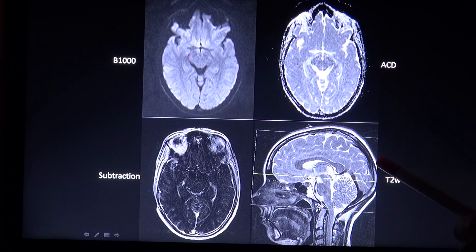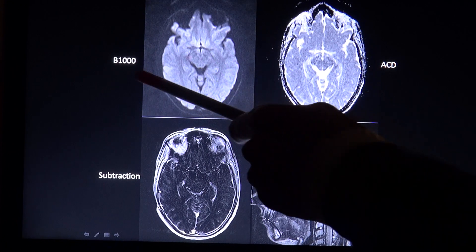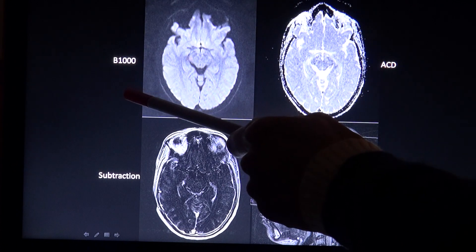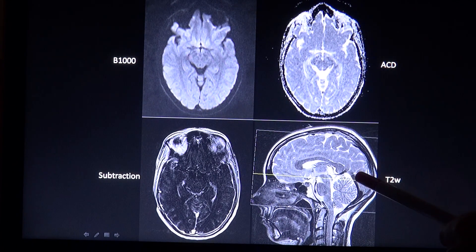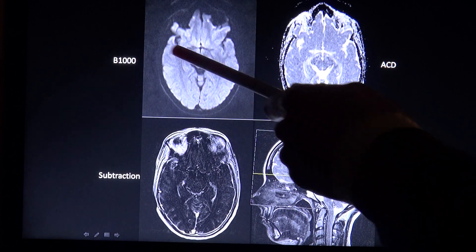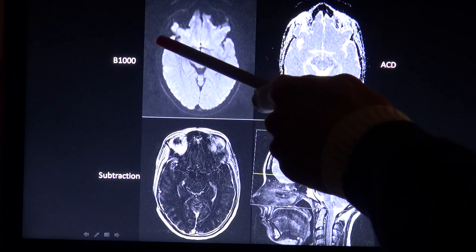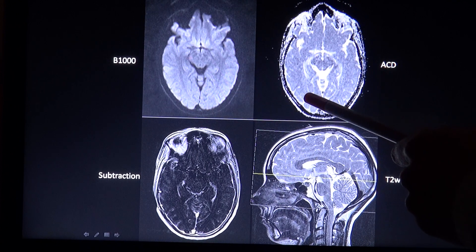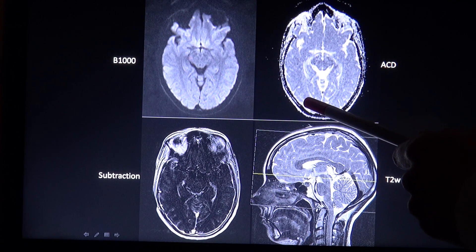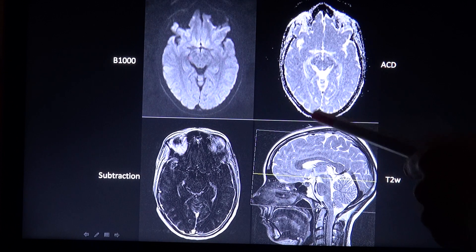For brain imaging, the image with a high B value, namely the B800 or B1000 image, is important to look at. The B value is mostly written in the corner of the image. This image is sensitive to passive diffusion of water and must always be correlated to the ADC map, which contains the actual data relevant to the diffusion image.